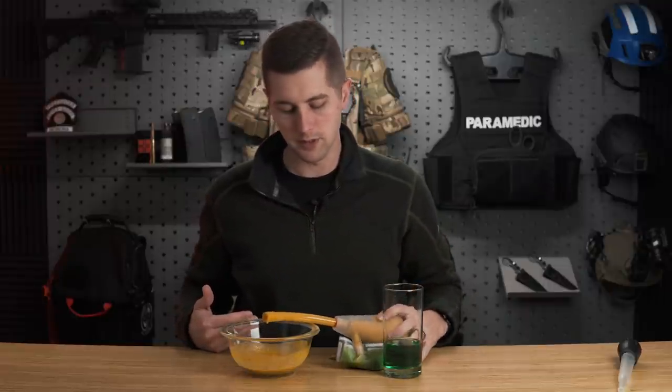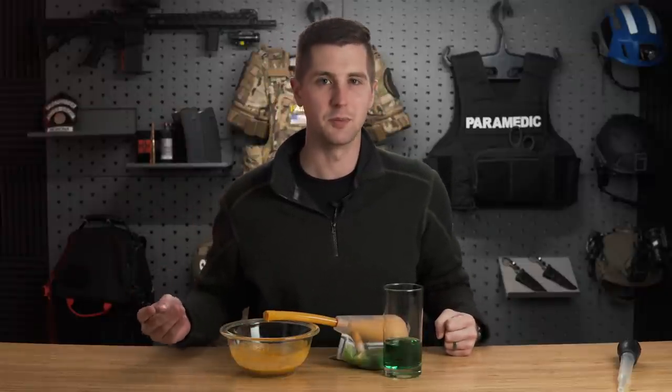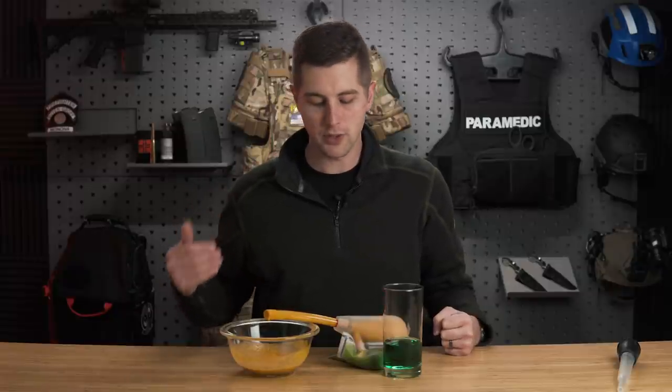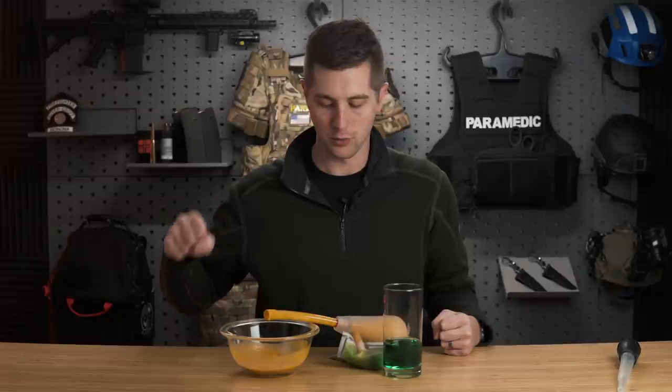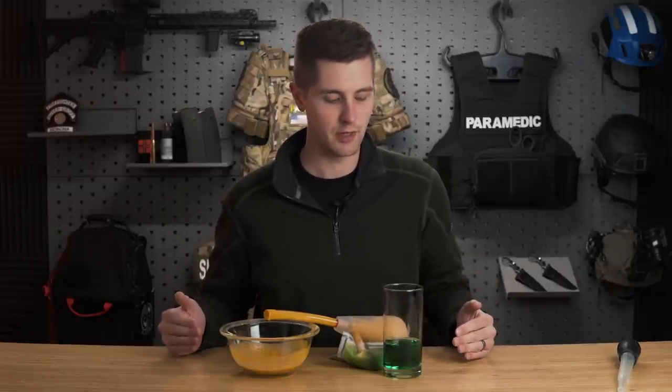So the process for suctioning a patient: number one, we don't want to do it for more than 15 seconds if feasible, but this isn't a hard and fast rule. We also don't want to go super deep beyond where we can see the tip of the catheter. Generally speaking, we can measure from the bottom of the ear to the corner of the mouth. We also want to be suctioning on the way out while we're doing it. Pretty simple procedure, but it is potentially life-saving.